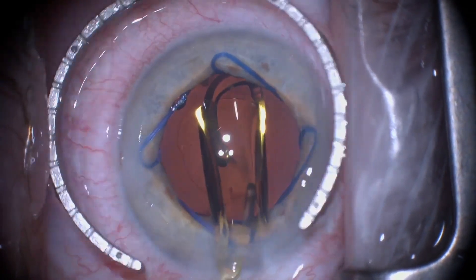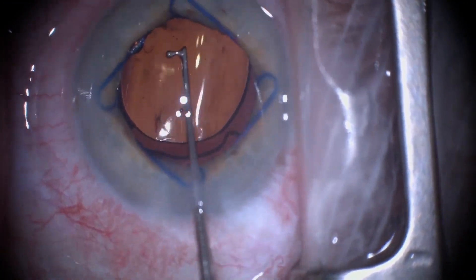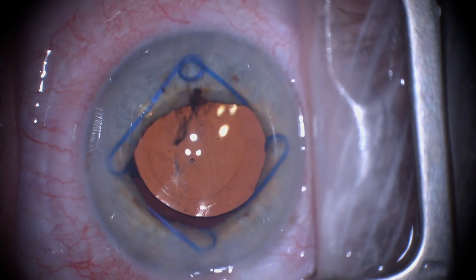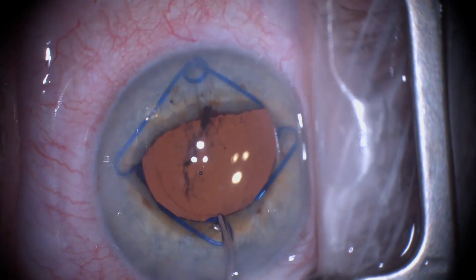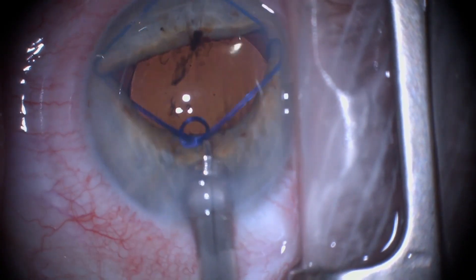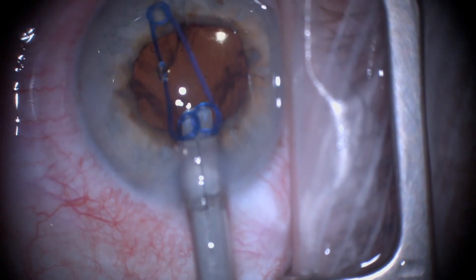Once the intraocular lens has been inserted and centered as we are doing here, the distal scroll of the Malyugin ring can easily be disinserted. The Malyugin manipulator is then reintroduced into the eye, and the proximal scroll is easily grasped and disinserted from the iris. The inserter device is then placed into the eye, and the proximal scroll is ensnared, allowing for seamless removal with minimal iris manipulation. I have found this technique to be friendlier to the iris than simply grasping and removing the ring from the eye.